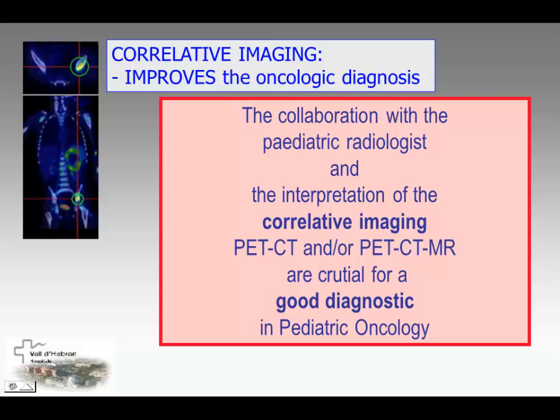Well, this is not the topic of this lecture, and as we are going to speak about bone, I am not going to speak deeply about that. But in fact, the reference tracer for neuroblastoma is MIBG, and it is available labeled with iodine-123, and we always perform SPECT images of the whole body and of the thorax and abdomen.